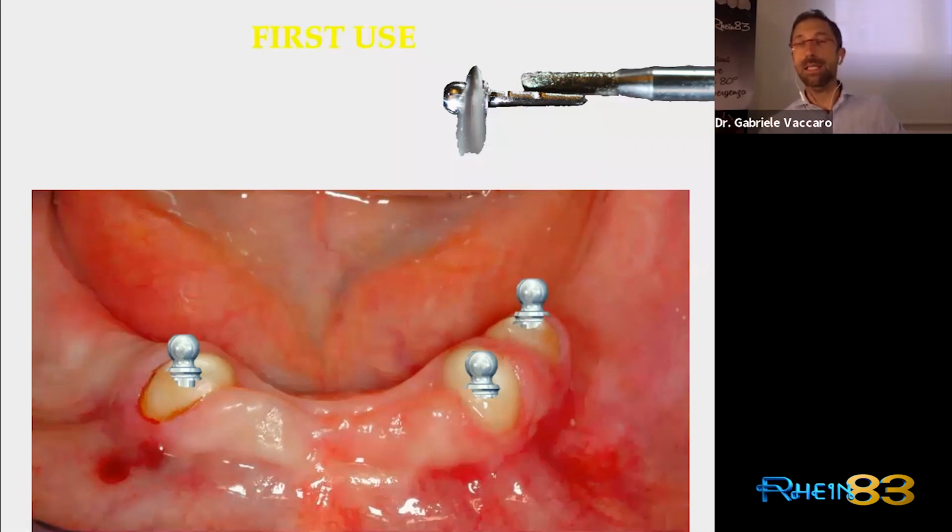That must be as low as possible. So if it doesn't get the lowest position, then try to cut away the metal from the pivot again and again until we reach the lowest position that we can have.